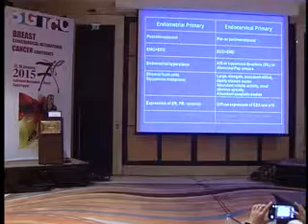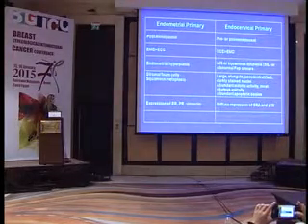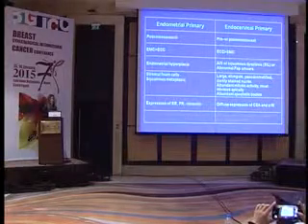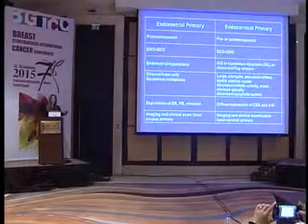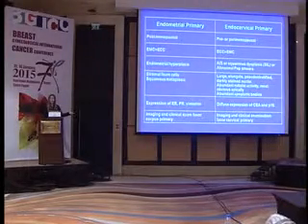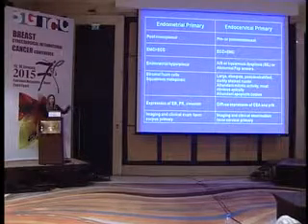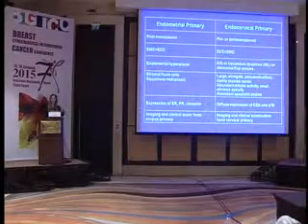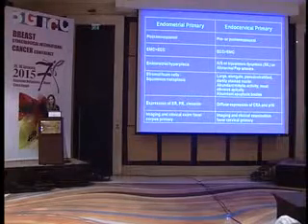Expression: ER, PR, and Vimentin positive. The other one, diffuse expression of CEA. P16 might be tricky, and I'll tell you. And again, at the end, you throw it to your physician. I cannot tell you, and there's nothing wrong with that. I did my best, I did the stains, I did recuts, I showed it. You go back to your gynecologist and tell them to do more studies, and there's nothing wrong with that.